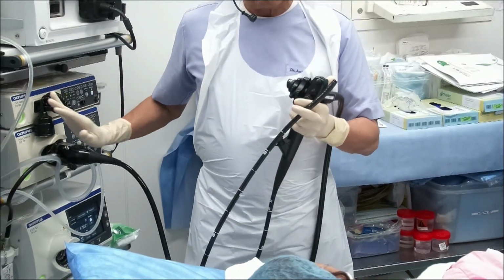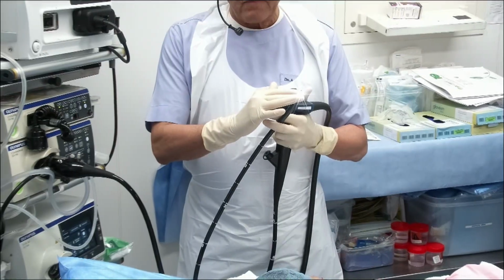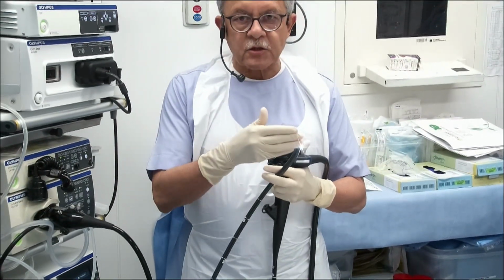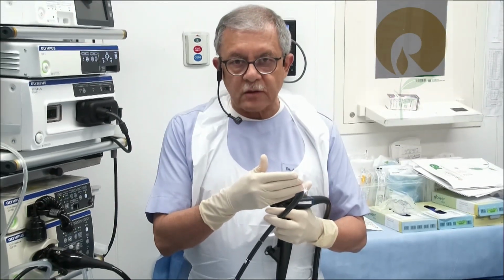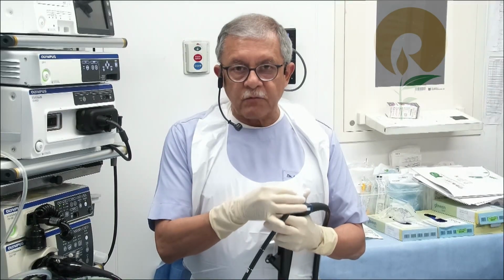There is a cold light, so the tip of the endoscope, from where the light is coming out from the camera, does not become warm. It is a cold light, because until that light gets transmitted, there is no heat which is generated. And this is now a camera. This is no more a fiber optic system. It is a video endoscope.